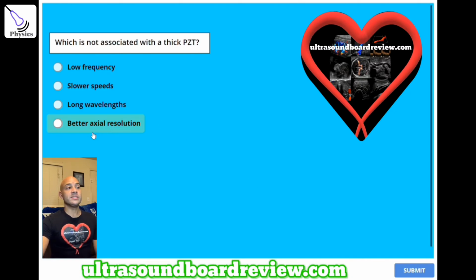The answer is D. Better axial resolution. Axial resolution doesn't really improve with a thick crystal because that means you have a lower frequency. However, if you have a thinner crystal, this will increase your axial resolution because you'll have a higher frequency.